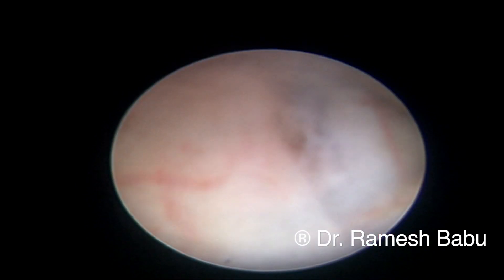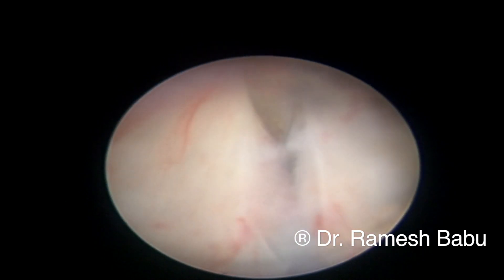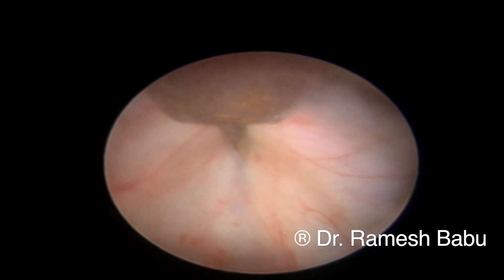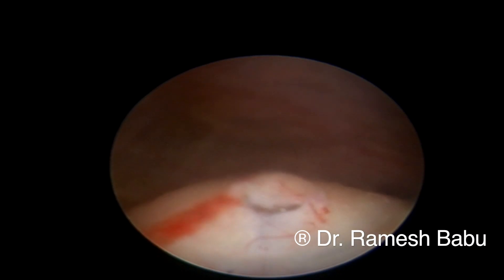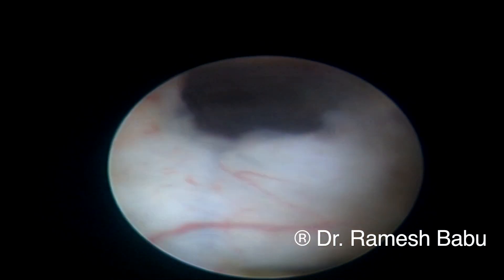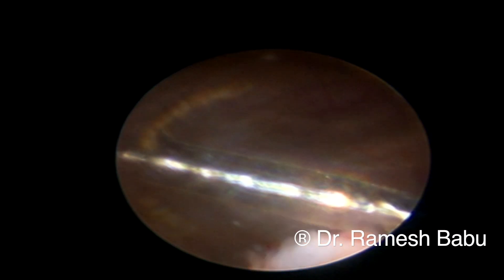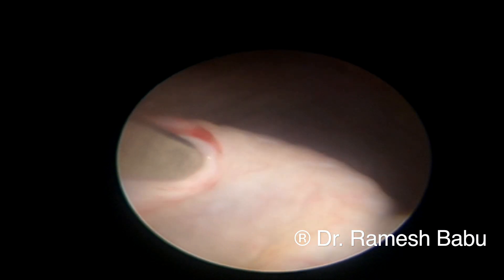We made a small puncture at six o'clock to create an opening, and with the help of a sickle-shaped cold knife we enlarged this into a smile-shaped incision so that the flap itself acts as an anti-reflux mechanism. The sickle-shaped cold knife is seen going in to enlarge the opening made at two different positions. This resulted in a nice collapse of the ureterocele, and the bulge seen earlier is no longer visible.